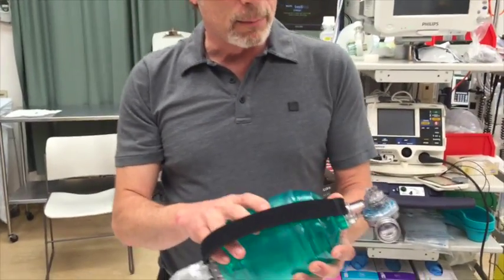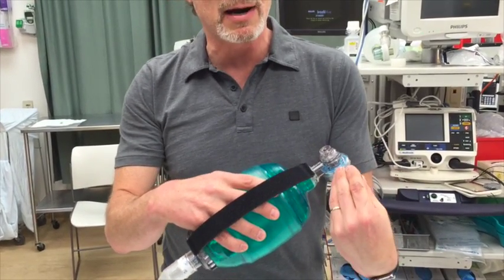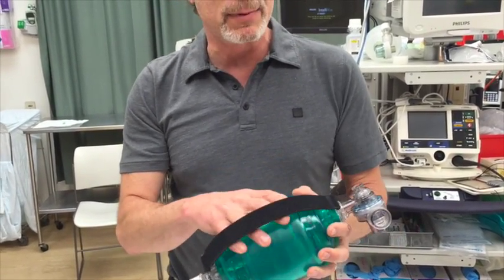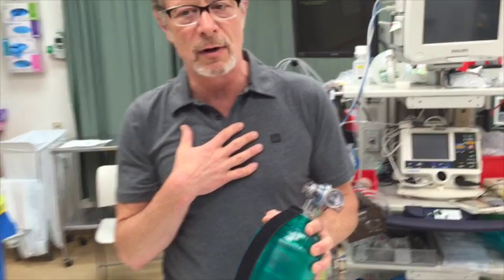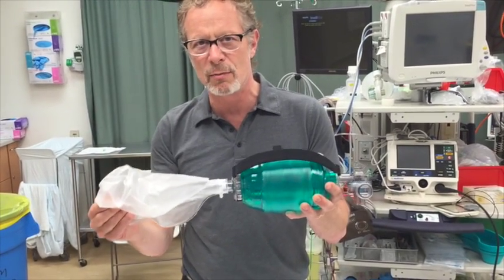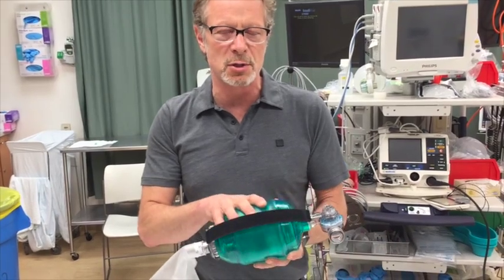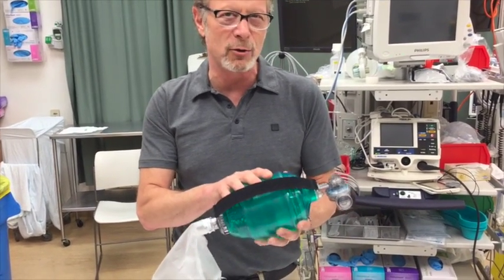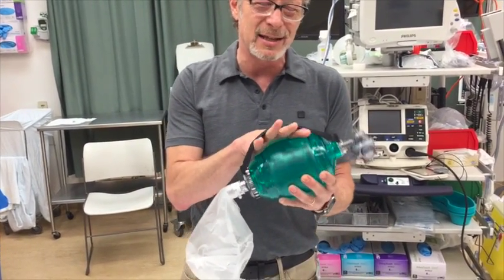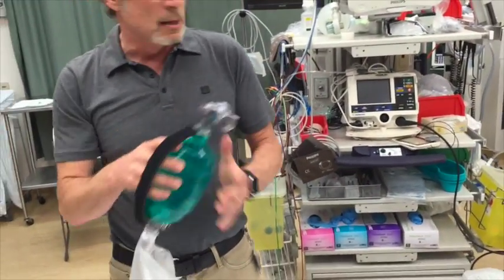The problem is that you will entrain air through the expiratory port. It's meant to be an expiratory port, but if you're breathing at a high rate with high minute ventilation that the system can't supply, it's going to entrain air through there, diluting your oxygen delivery. Some say in spontaneously breathing patients these will deliver anywhere from 50 to 70% FiO2.